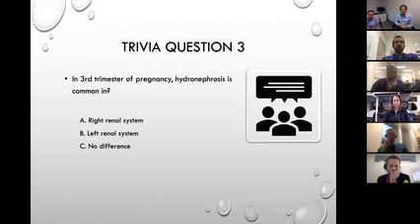Oh yeah, I like this question. We had this question in our exam, so I'm just going to put that up here. Late trimester pregnancy, you get hydronephrosis, and which side is it common? Clinically, you shouldn't be calling that hydronephrosis or doing anything about it. Just let it go. So if you see this: right, left, no preference, or none? The most recent one here is being pregnant.